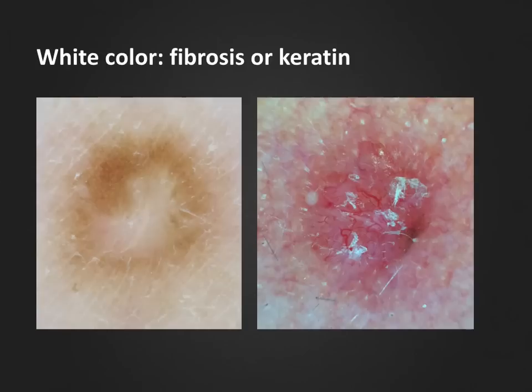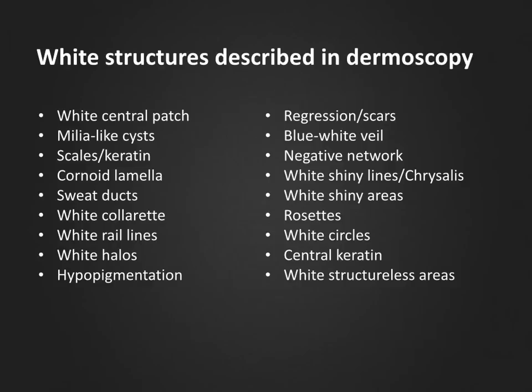We can see white color due to fibrosis in the typical central white patch of a dermatofibroma, as seen in the picture on the left, or we can see white scales on the surface of a basal cell carcinoma on the right. It is important to observe that the mere presence of white color due to fibrosis or keratin is not diagnostic by itself. It is rather the combination of white color with other local structures that provides the diagnosis. In the dermatofibroma, the central patch is surrounded by a light brown pigment network in the periphery. In basal cell carcinoma, the white scales are not particularly expected, but the presence of typical branched vessels points us in the right direction.